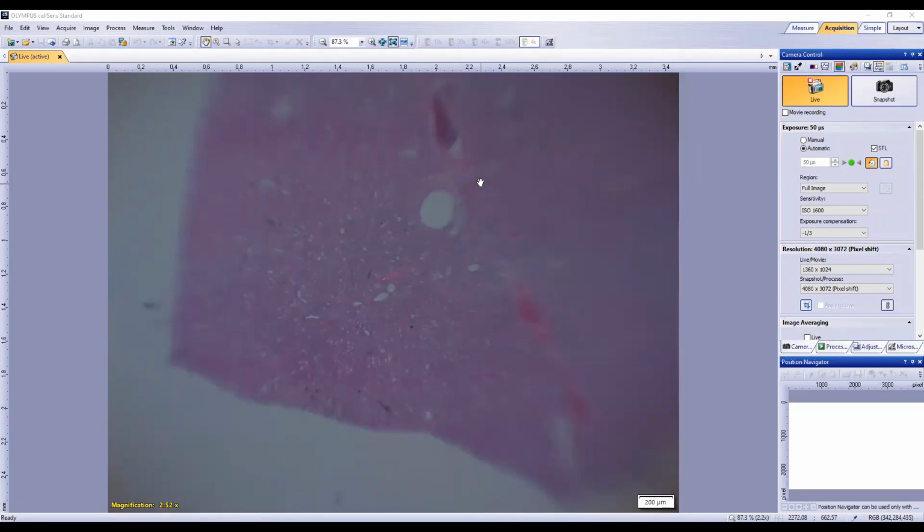Now, Kaylin, you've asked about thrombosis. Talk us through that. I apologize in advance for my English. All good. So I think those are blood vessels with thrombosis because I see some smooth muscle, but I'm not very sure at this point with this magnification. Yeah, exactly. So another thing on the list that we're going to need to examine for. And I can see we definitely do have some blood vessels, arterioles more specifically, with that thicker wall, and these large aggregates of red cells in the middle.